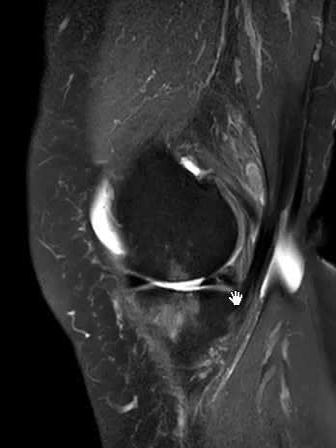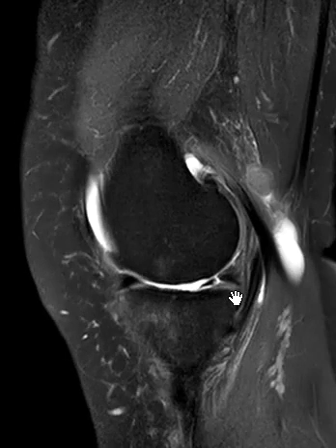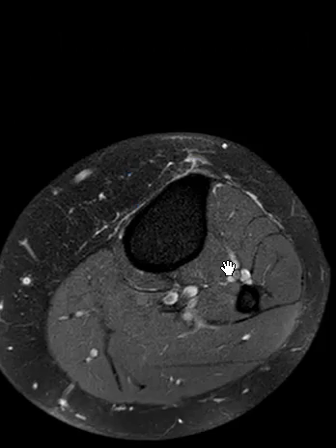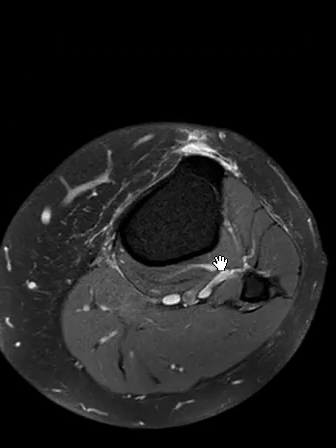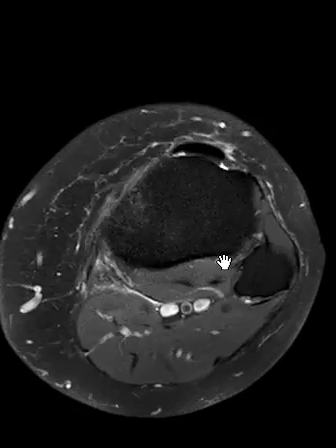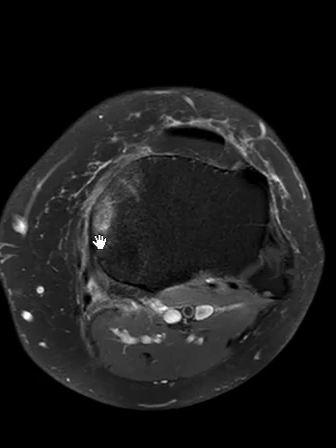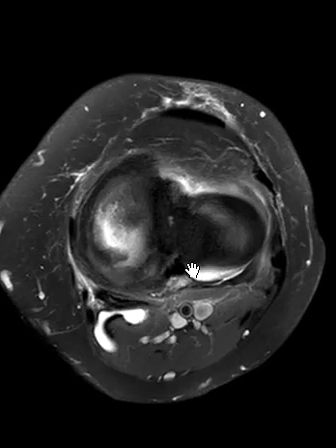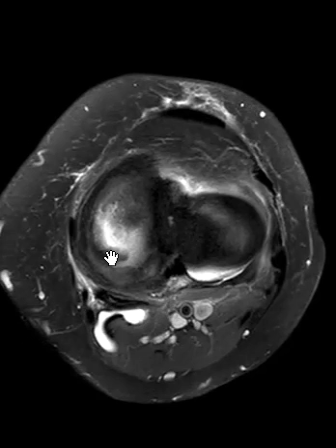It almost looks like a radial tear, but it's obliquely oriented. We can see this on the axial sequence — going over to the medial side here, towards the back, and this is it right here.